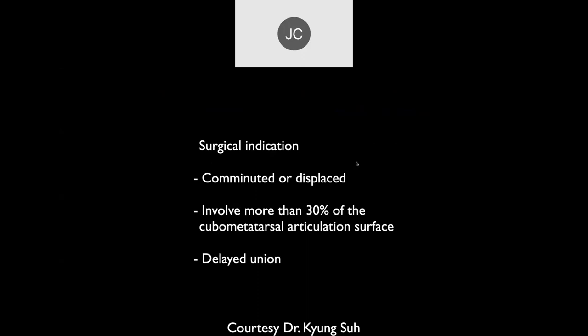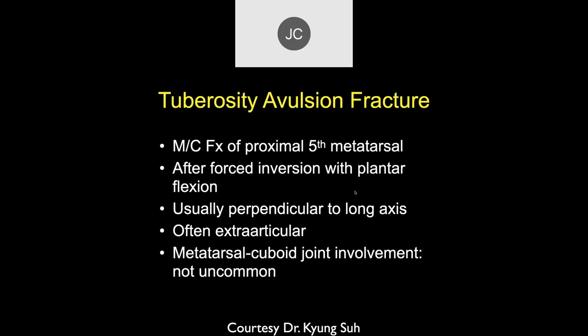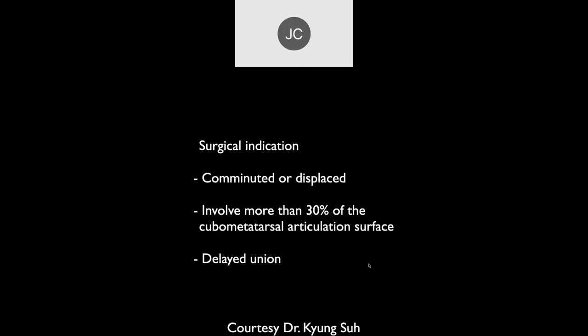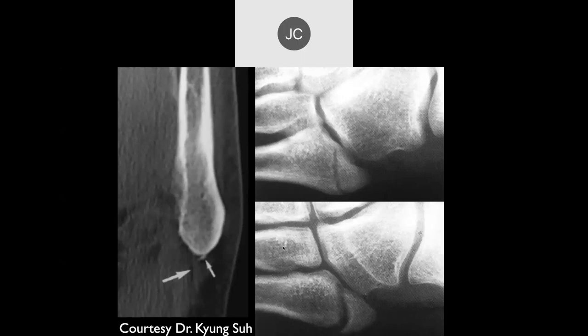Avulsion fractures at the base can be longitudinal or transverse, and can be extra-articular, just involving the tip, or can involve the metatarsal-cuboid joint as well. Surgical indications are if it's comminuted or displaced, or if it involves a significant amount of the cuboid metatarsal articulation. Delayed union can occur, but most of these are treated non-surgically. The fractures vary in terms of location depending on the type of injury, and if it involves the joint, it's typically from a tendon pull.